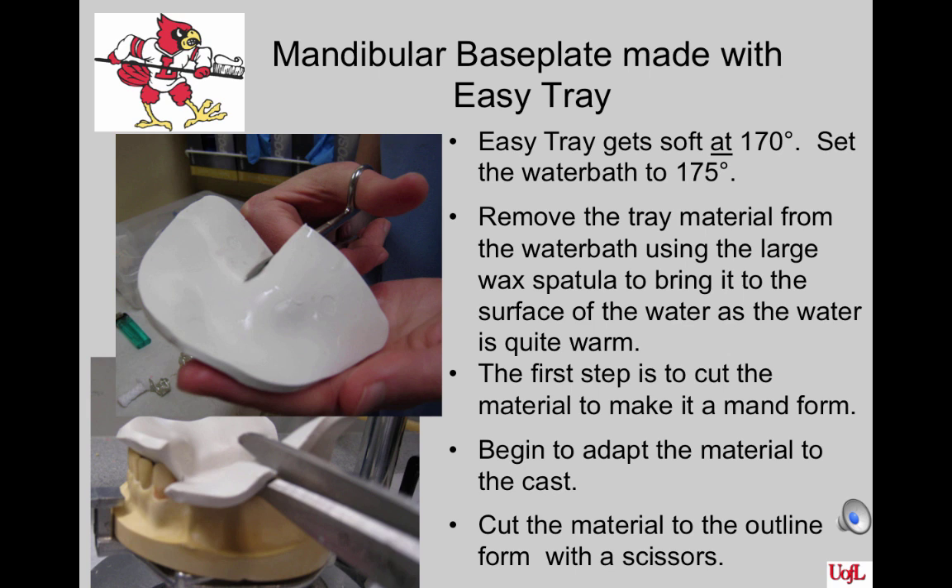The material we will use on the mandible is called Easy Tray. It gets soft at approximately 170 degrees; the water bath should be set at 175. Use the thermometers to ensure the right temperature — some are a little old. Check the material for softness using a large spatula. Remove the tray material when soft from the water bath using the spatula, as the water is quite warm. The material will not be hot to the touch. Cut the material to make a mandibular form by cutting from the wide end forward, as shown in the picture.